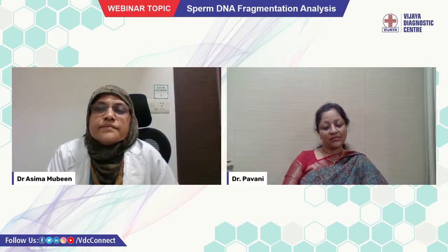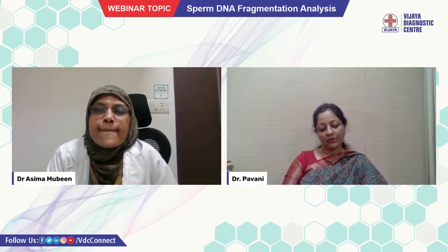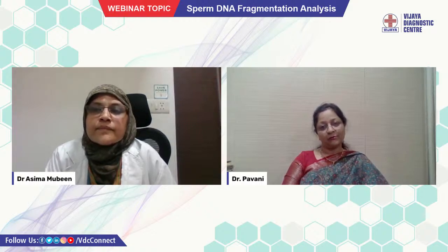Now, the take home message is that testing on DNA fragmentation analysis earlier during the infertility evaluation process can ultimately save time, energy, and money, and also prevent the couple from undergoing more invasive procedures.